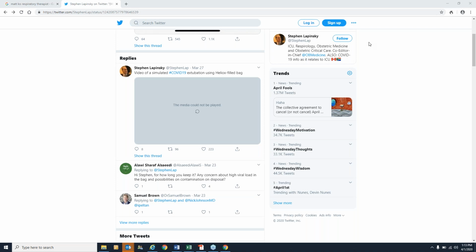But you need to be mindful, if you're doing this in your ICU and then you're proning a patient, there's a higher chance of extubating the patient depending on how you're taping. You want to be able to see if there is a disconnect. So I'd be very personally hesitant to do this in our setting, and would instead do what Matt's suggesting: making sure all the connections are tight and your circuit is appropriately secured, and looking at all the factors that would lead to an inadvertent disconnect, versus trying to have tape cover that up.